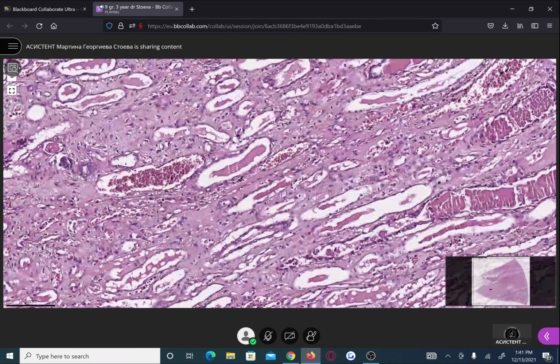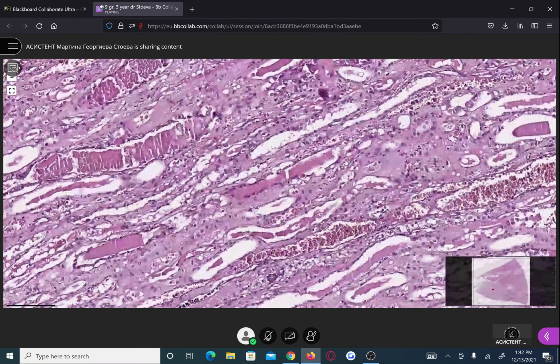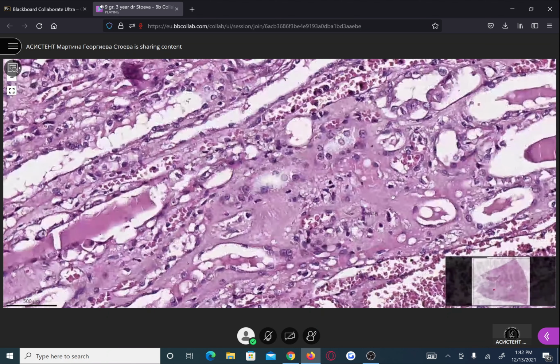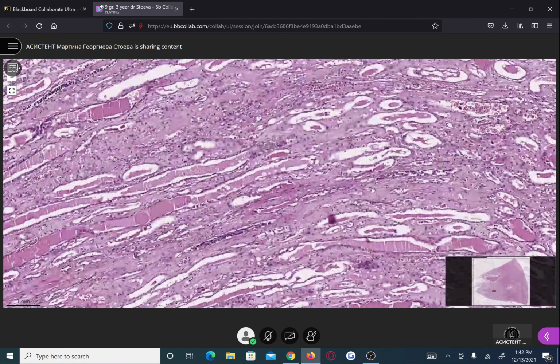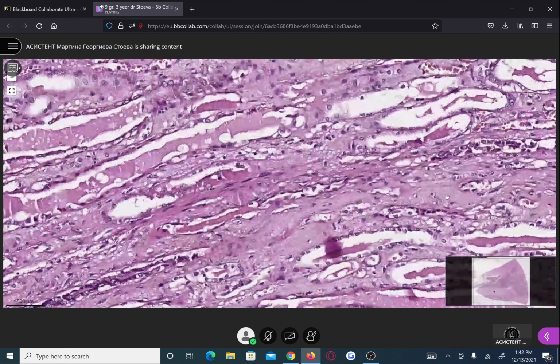The only other thing I can give you that might help is that in the interstitium, we can find some areas that look more homogeneously pinkish, so this could also be amyloid deposits. Here again. But of course, we should check it with a special staining.